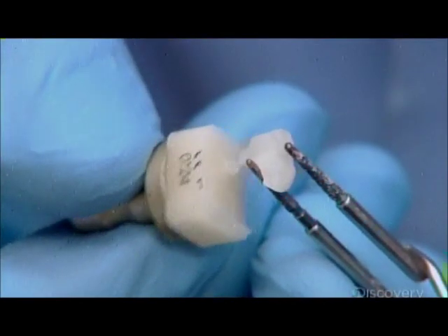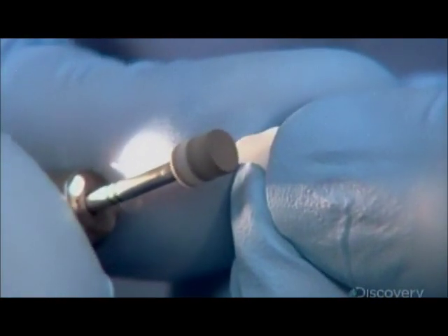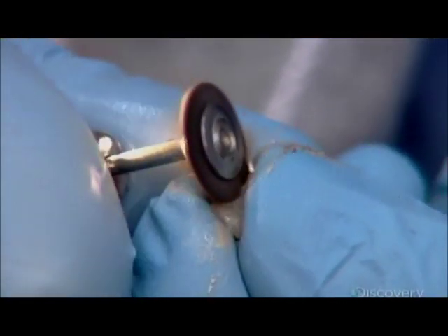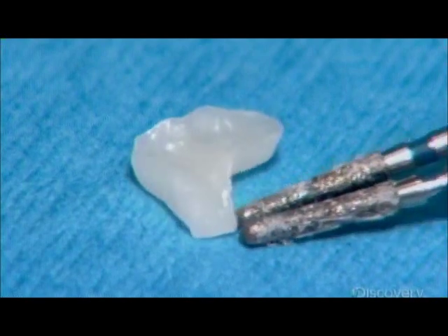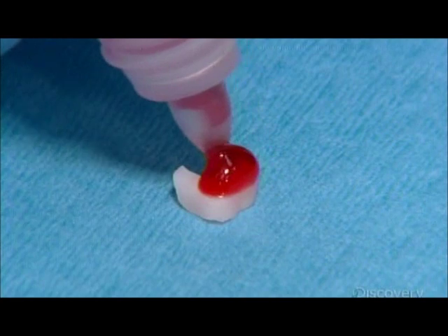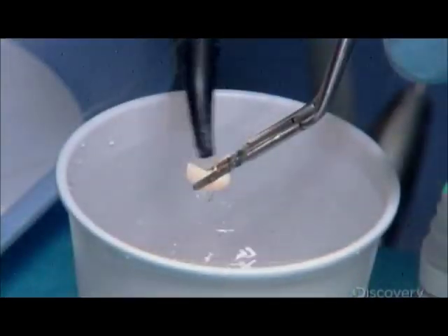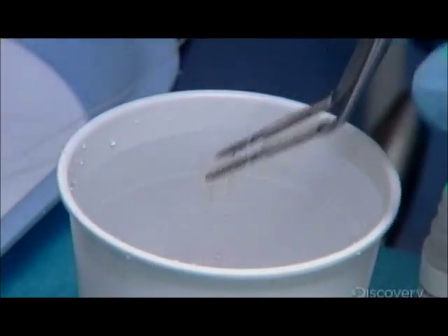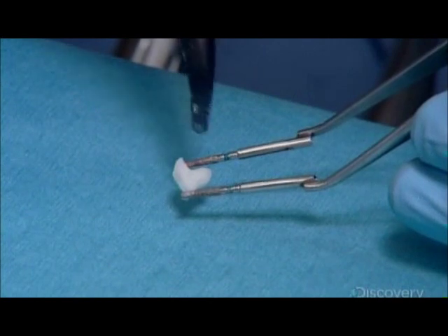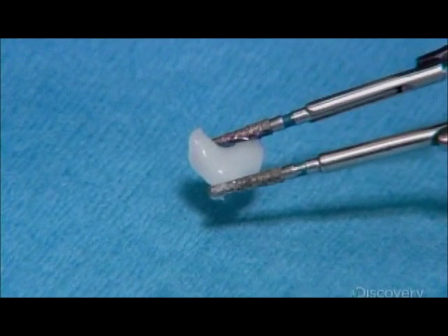The dentist then pulls the ceramic inlay from the base. This leaves a small nub, which he then grinds away. Next, using rubber wheels and diamond-impregnated brushes, he polishes the entire restoration to a high gloss. He conditions the inlay with hydrofluoric acid to prepare it for adhesion to the tooth. He dips the filling in water and the hardened solution flakes off. He then thoroughly dries the inlay and adds a drop of silane, which will promote the bonding of the inlay to the tooth.